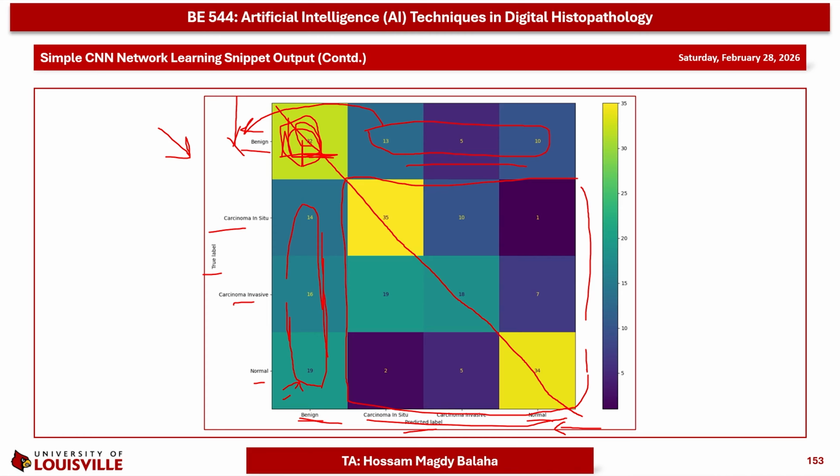Then we reflected all of those in our script by knowing how to build the model, then read the data, preprocess it, making it ready for the training, then starting the training. And once the training is completed, we can use the evaluate function if we need the evaluation, and we can use the predict function if we need the predictions as a value, just in case we don't have the ground truth and we need only the prediction of the tuned system.